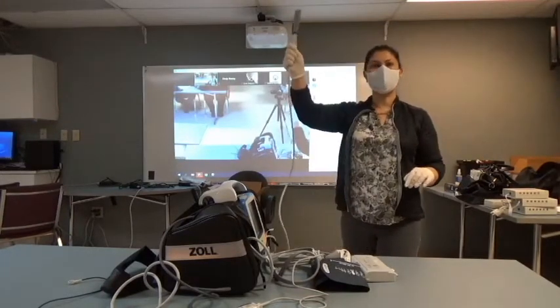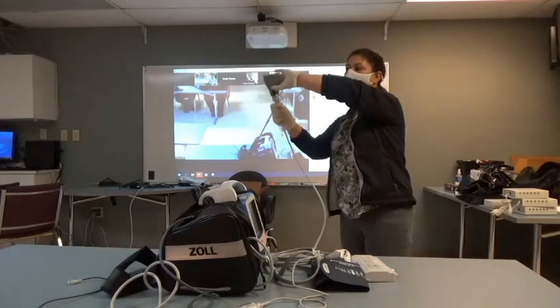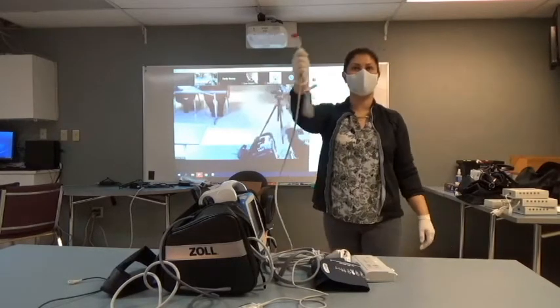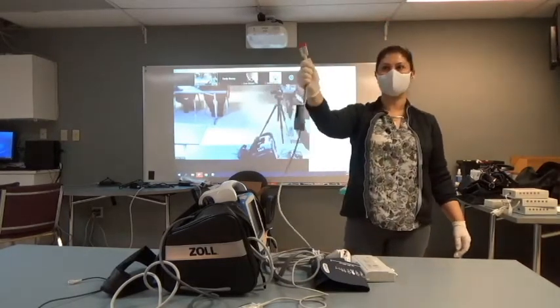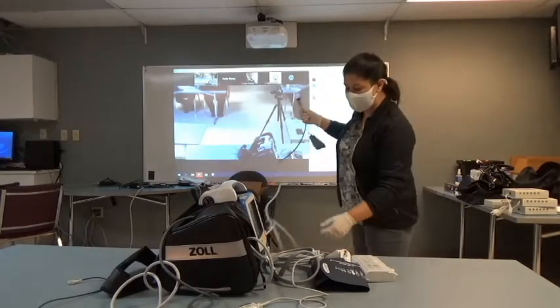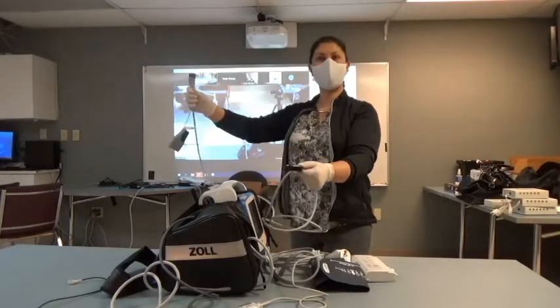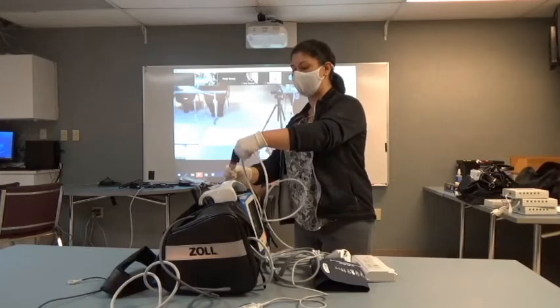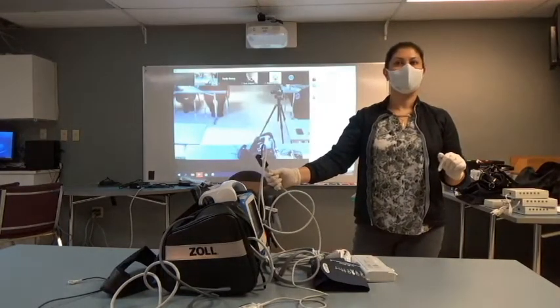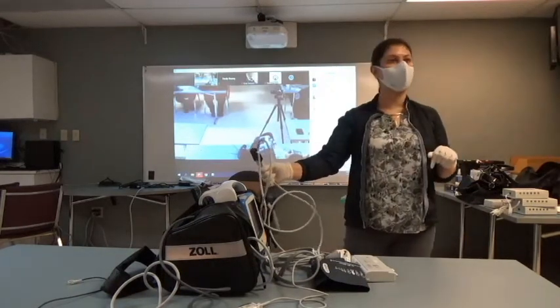The very end of this has a gray adapter with a black button. If you press that black button and pull, you're going to end up with a red piece that says this side up. There is a little test box that's attached to your cable. It also says this side up. At some point during your checkout, we're going to ask you to connect the two together. You'll run it up to 30 joules and you'll deliver.